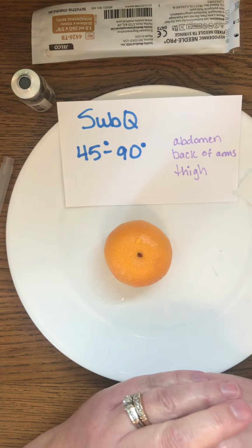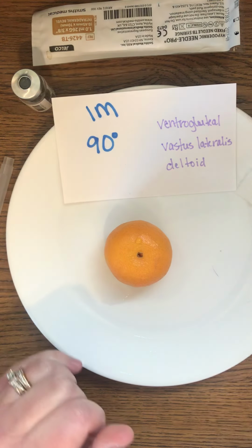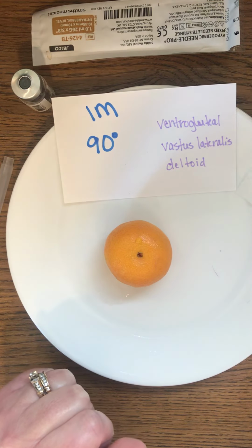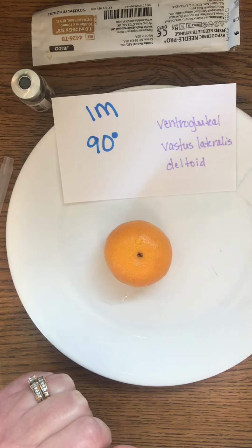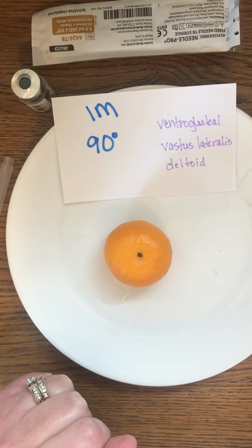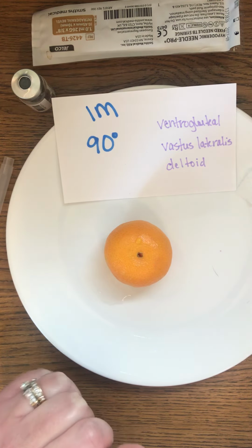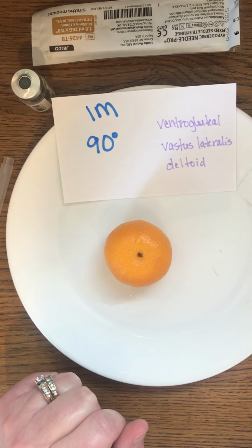All right, and finally, we're going to talk about an intramuscular injection. And again, the length of the needle for intramuscular is going to vary on the size of the person, but the needles can be anywhere from 1 inch to 3 inches. Typically, you're going to see 1 to 1.5 inches. The gauge of the needle is going to be a little bit larger, so 21 to 25.